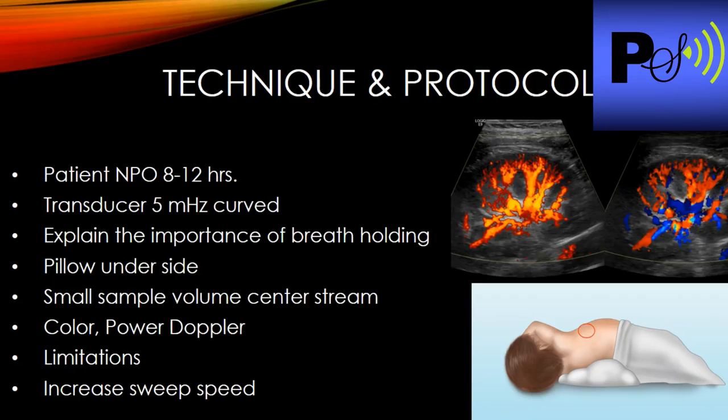You should use a curved transducer, anywhere from 3 to 7 megahertz. You can stay in the 5 megahertz range, but if your patient is very small or if it's a baby, don't be scared to use the 9 linear or even the 15 linear.